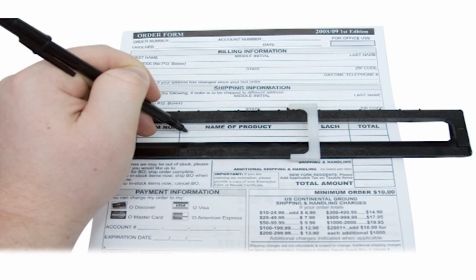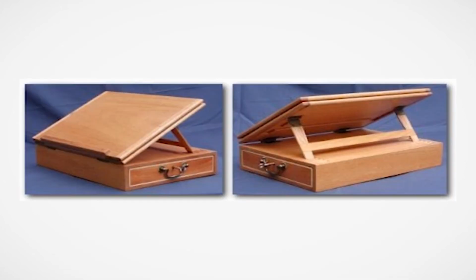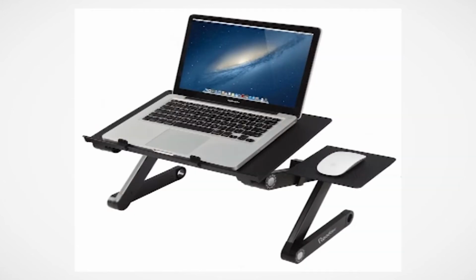Raised top desk. Some students prefer a sloping surface for reading and writing. Raised top desks are available, or portable reading stands can be placed on a flat surface. Students working on computers or typewriters use a variety of commercially available typing stands which position material within a comfortable working distance. It is used to avoid back strain or facilitate proper positioning of the reading surface.